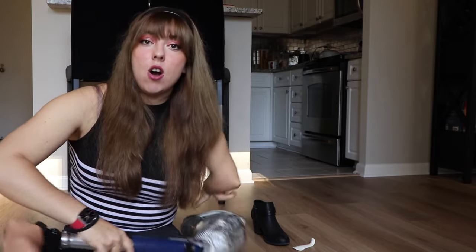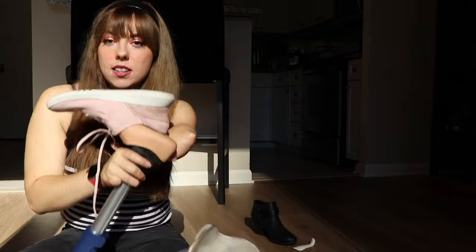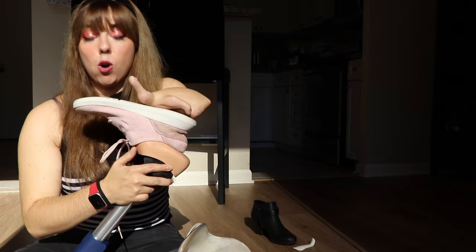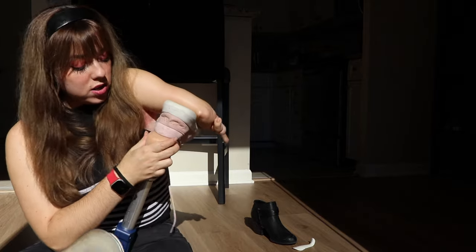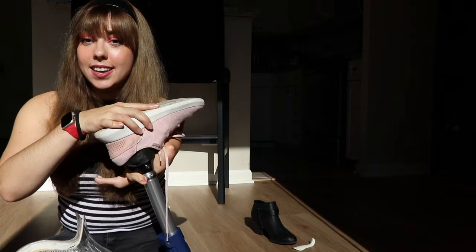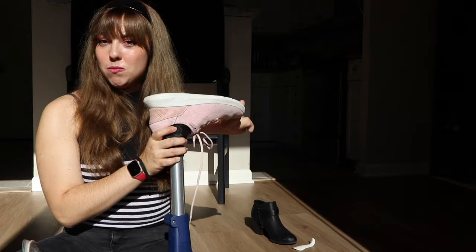I typically like to put my shoes onto my prosthetic before I put the prosthetic on. As you can see, I have my prosthetic bent where the foot is facing up, and then I put the shoe — the foot is in the flat position because I most recently wore a gym shoe. From this point, it's just a fun little wiggle game. Even though this is an adaptive shoe, I could still slide the shoe horn in here to help, but I was able to do that pretty seamlessly without pulling from the back. There you have it — the gym shoe is on.